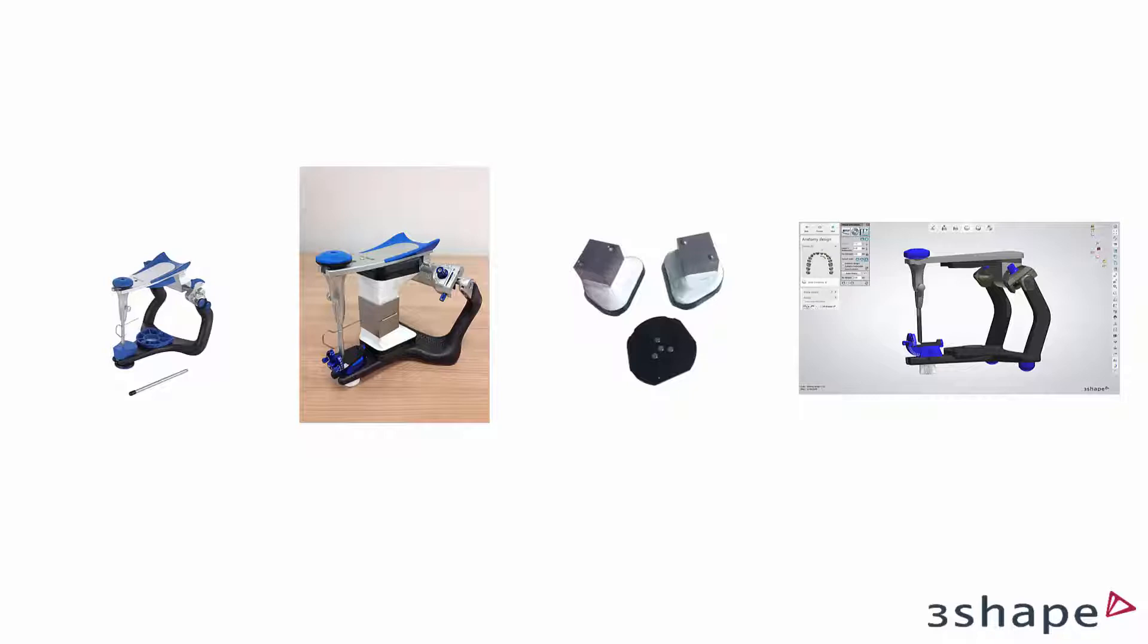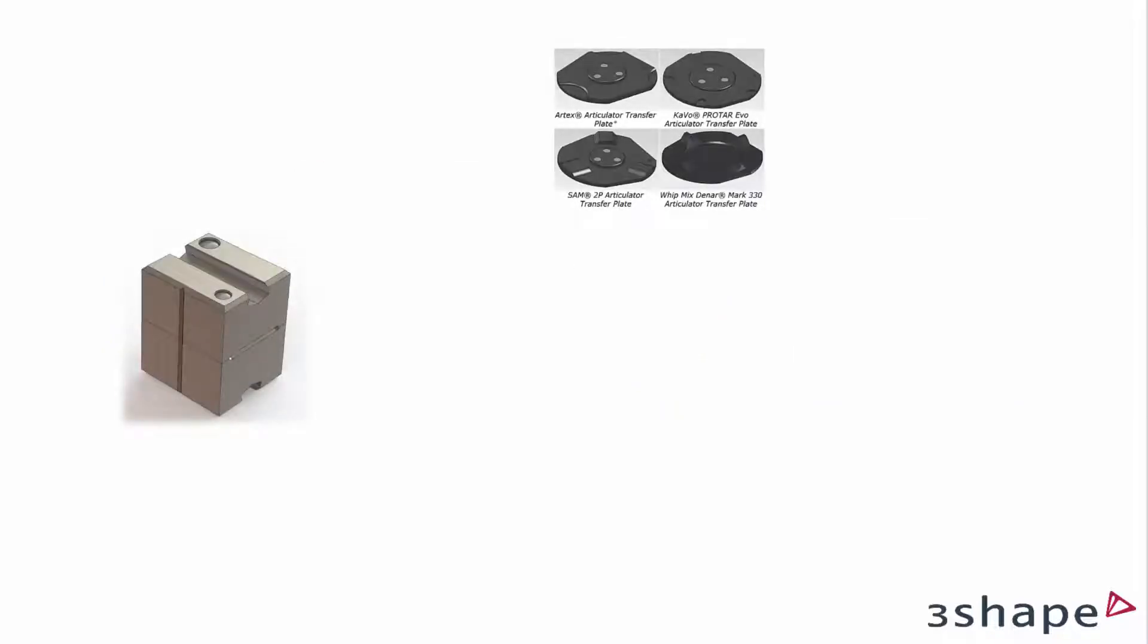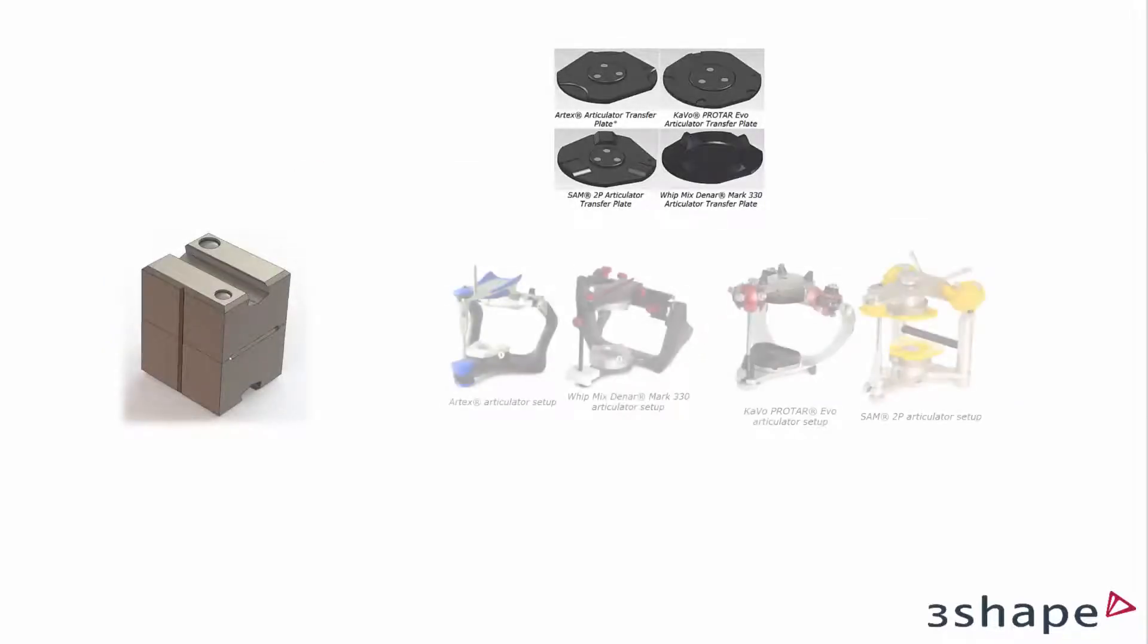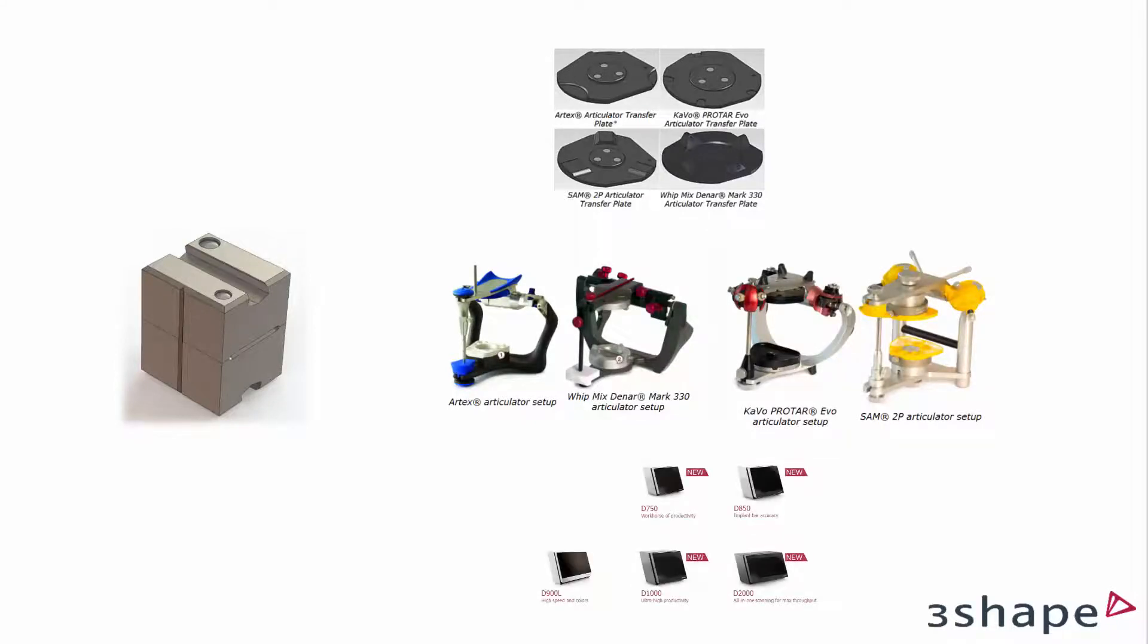If you have multiple articulators, it should be done for each of them. The calibration object can be used with all the transfer plates and articulators available in the dental system as well as all scanners except the D500.